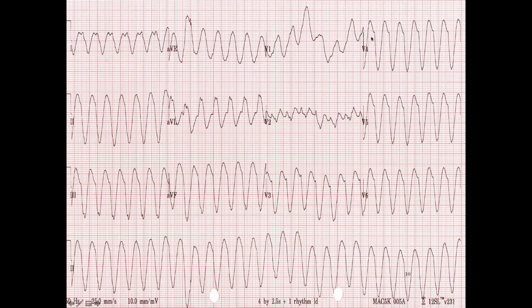So looking through this Brugada criteria, we do have precordial concordance. They're all going in the same direction. They're all negatively deflected. Look at that. So that checks that off. So I'm thinking V-Tach. Well, do I have Brugada's sign? Are these complexes in the precordials, focusing on the precordials, abnormally wide? Yeah, maybe just barely abnormally wide. So we might be just on the precipice of Brugada's sign.